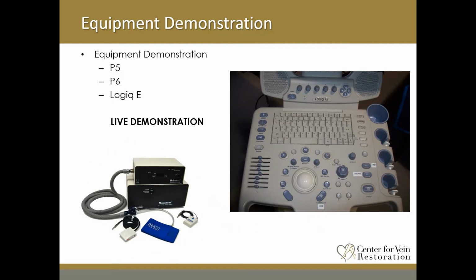Here we have our pneumatic cuff inflators. The pneumatic cuff inflators are critical to our practice in that while these scans can be long for the sonographers, for yourselves as you're trying to learn these exams, the pneumatic cuff inflator gives flexibility to the sonographer in that it will automatically inflate and augment the vessels while they're scanning.